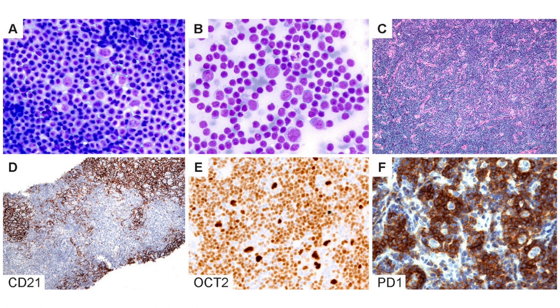For cytologic diagnosis of NLPHL, figures A and B show touch prep with LP cells in a background of small lymphoid cells and occasional inflammatory cells. Figure C shows an H&E stained core needle biopsy that does not readily reveal nodular architecture, but CD21 staining confirms the follicular dendritic cell meshwork and nodule presence. OCT2 with bright nuclear staining and PD-1 positive rosetting around LP cells further support the overall diagnosis of nodular lymphocyte predominant Hodgkin lymphoma.